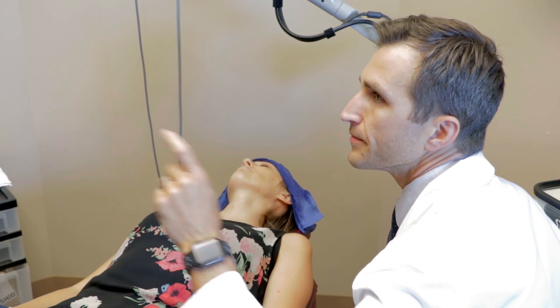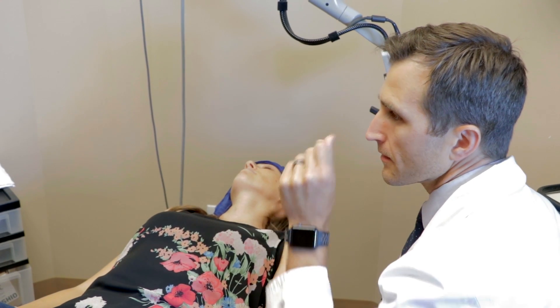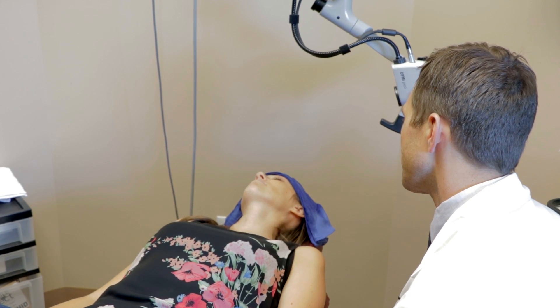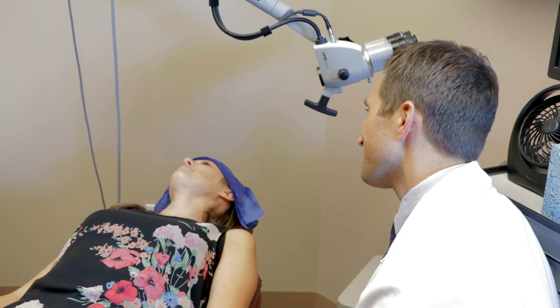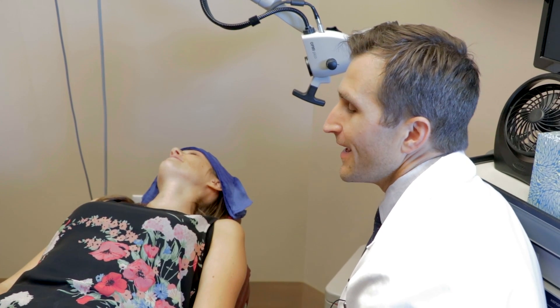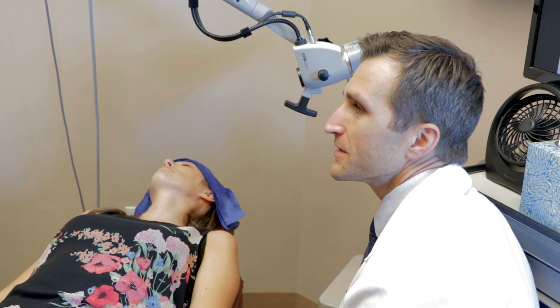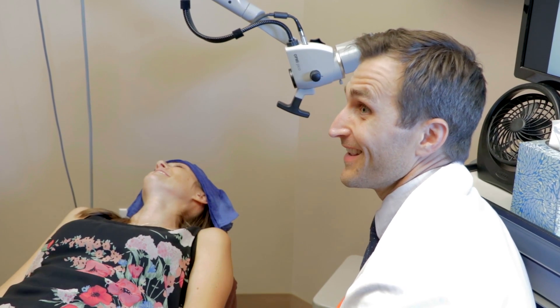She's got the thick eardrum and then the tube gets a little slimy from the numbing medicine. You can see it on the screen, right? It was bouncing all over the place. Let me know when you're feeling kind of normal again. We had this poor boy come in and we were doing something in his nose — he did really fine for it, but he didn't eat breakfast beforehand. And you didn't either, did you? I ate breakfast, but not like — I was kind of like, do I eat now? People are a little nervous so they don't want to eat. He did fine through the procedure, then he passed out in the hallway right out in front of everybody. Poor kid was so embarrassed — super tall, big kid.